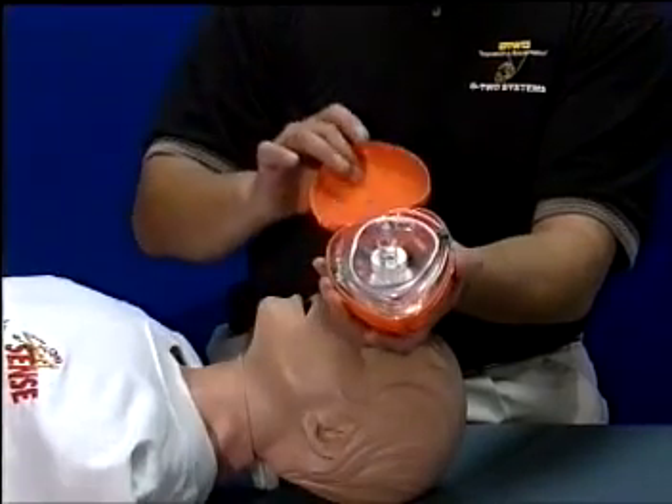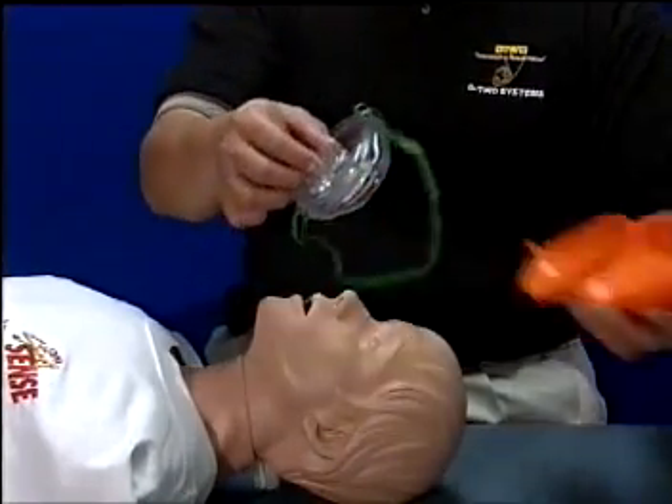The Rescue Breather CPR Universal Pocket Ventilator has been developed to meet the challenges of emergency rescue breathing. It is cost-effective and easy to use.